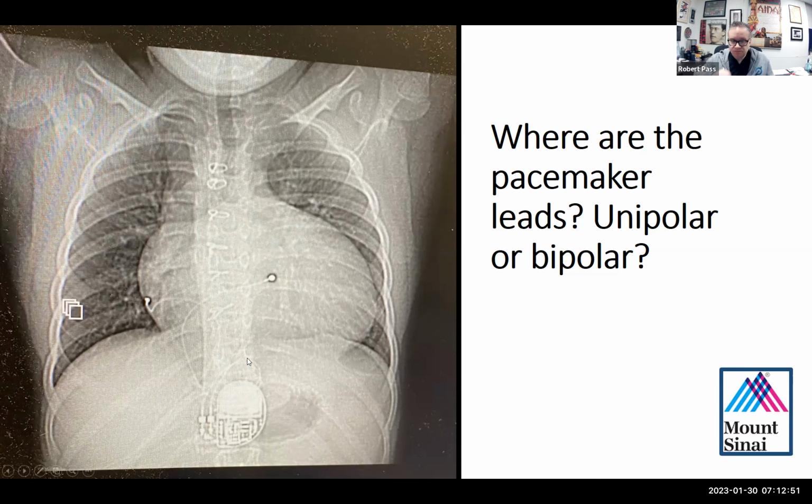So as a general rule, we would prefer a bipolar lead because, for example, a lot of pacemakers have as an emergency feature that if the device detects an impedance rise that is sudden and large, it will automatically convert to unipolar modality. And so that's a nice feature as a safety feature, both from the perspective of longevity of the lead, but also a safety concern. If a patient were to break one of the attachments to the heart, you would automatically convert to unipolar.